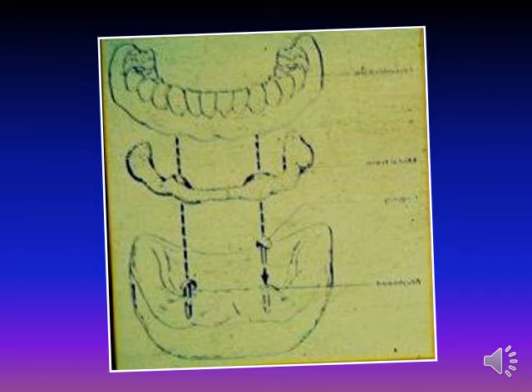The size of the primary coping may be short or long, and may be designed to provide support only or to provide both support and retention. The secondary coping or sleeve may be a special metal thimble or porcelain fused to metal restoration fitted over the primary coping and is at the tissue side of the acrylic denture base.